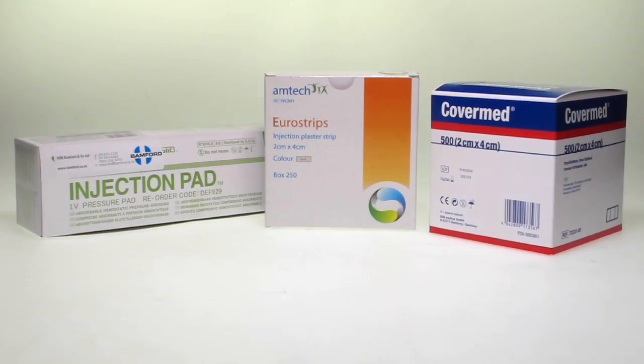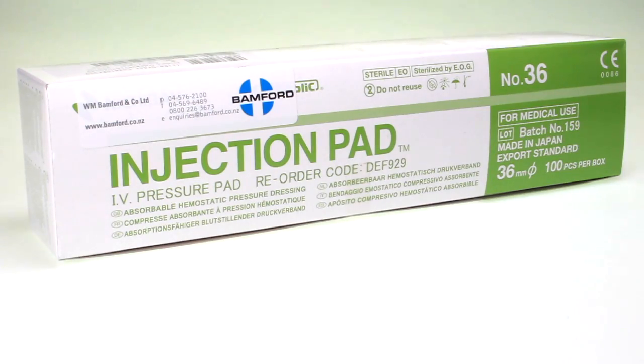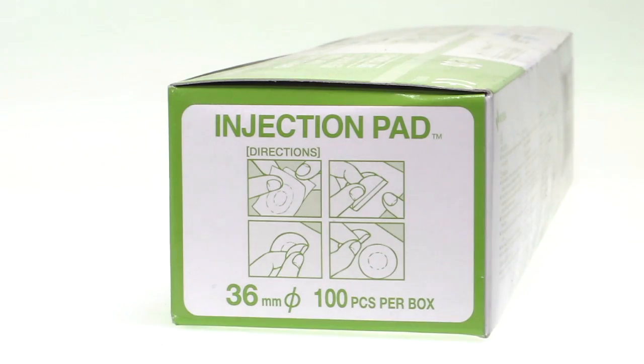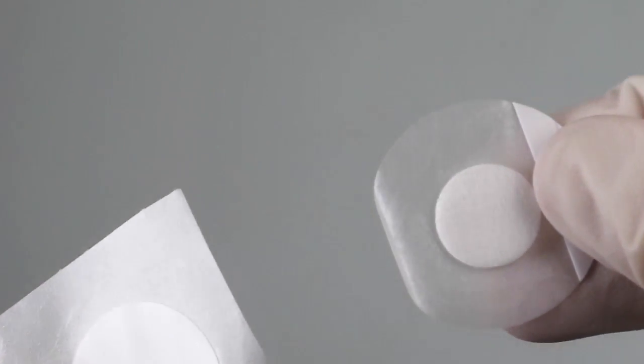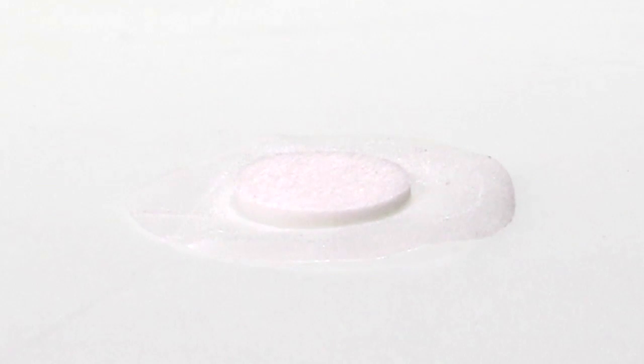Our range also features the IV injection strips with pressure pad available in a box of 100. They are a thick 36 millimeter circular pad made from cellulose fabric that is highly absorbent and helps to stop bleeding after an injection.